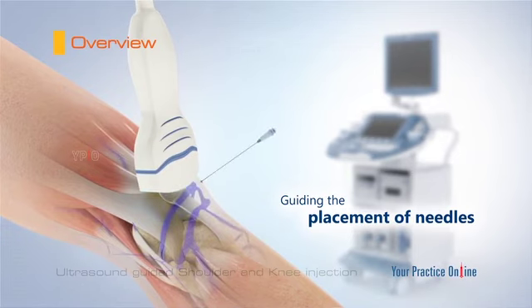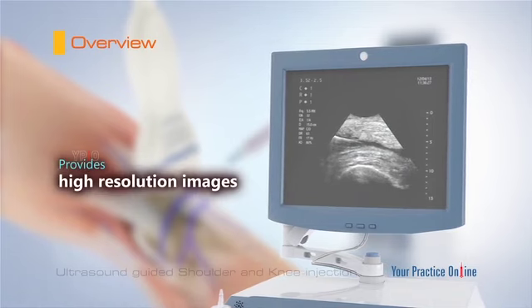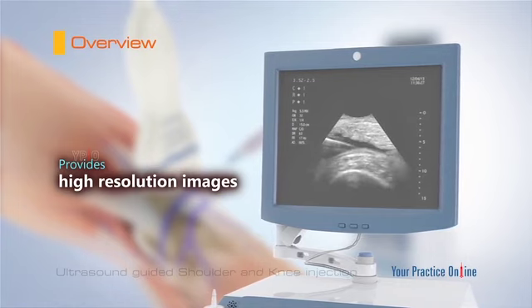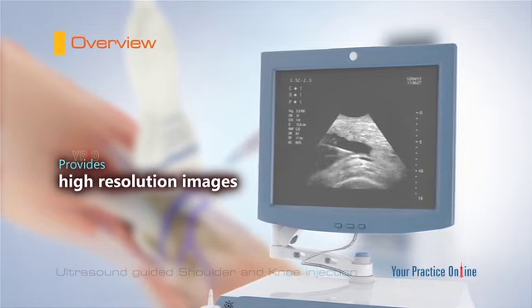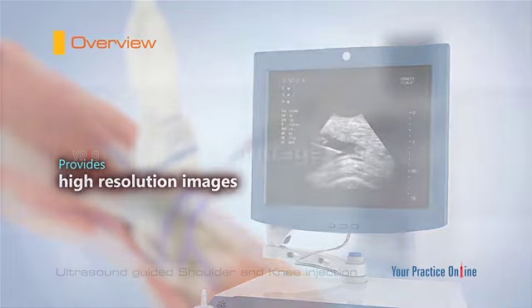Injection of a pain medication in combination with a local anesthetic directly to the site of injury helps to relieve pain. The advanced imaging of ultrasound provides high-resolution images that enable the physician to precisely locate the injections deep into the target tissue without harming surrounding tissues.